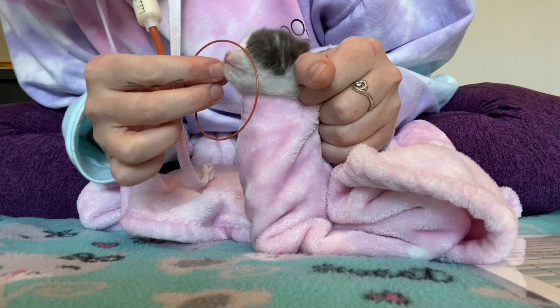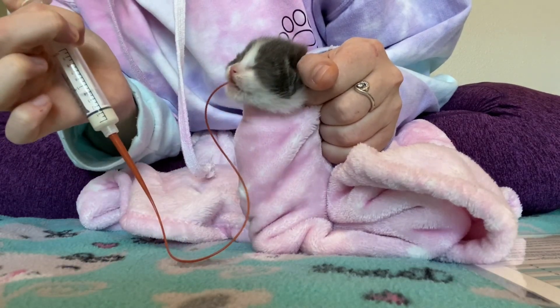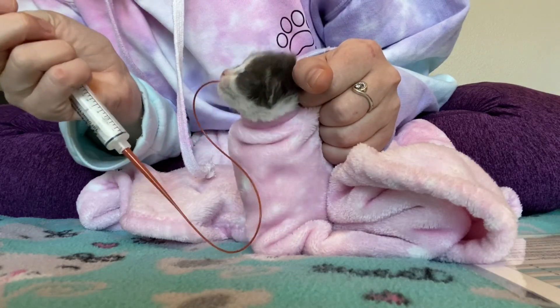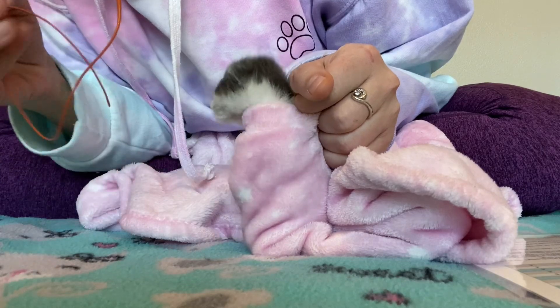If you need to, you can reposition that tube if it has started to come out of the mouth at all. Then just keep slowly pushing the milk in. And then I'm just going to pull that tube right out once we're done.